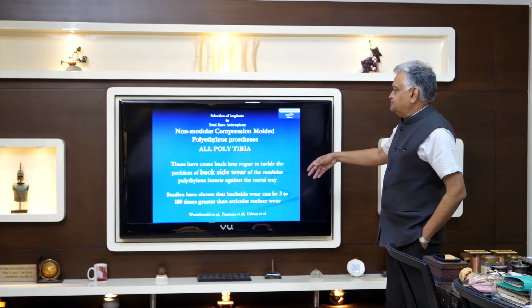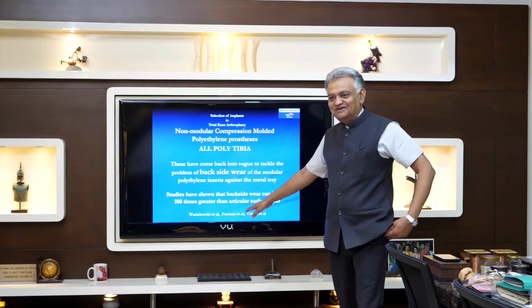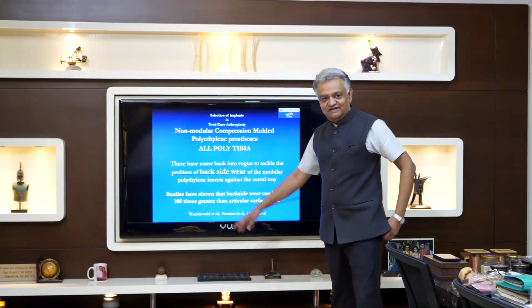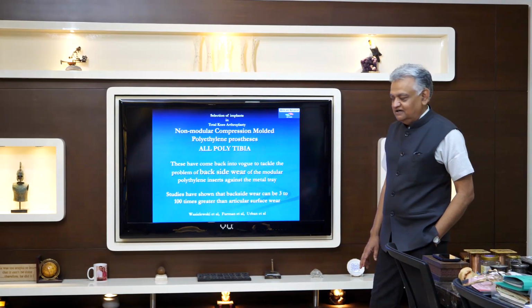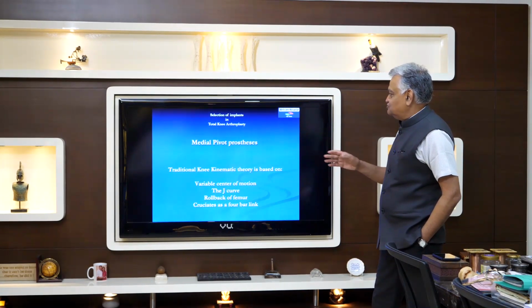Next please. And then you have the all-polyethylene tibia, and I won't go into this, this is a separate lecture in itself. The merits of the all-polyethylene tibia, yeah? But this is one of the best lectures that you will ever hear, and we'll do it as a separate thing. Next please. Next, let's go through to the end.